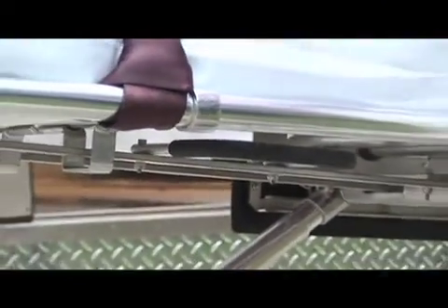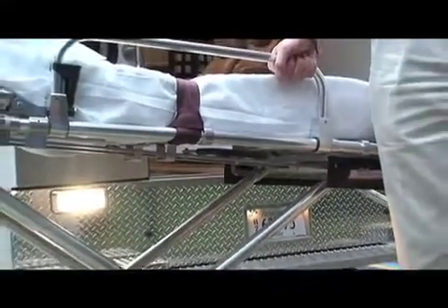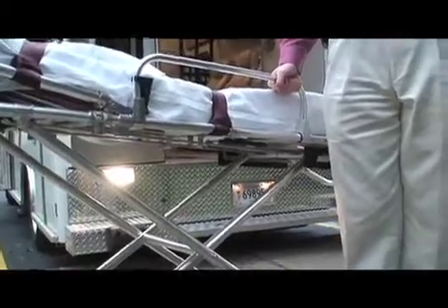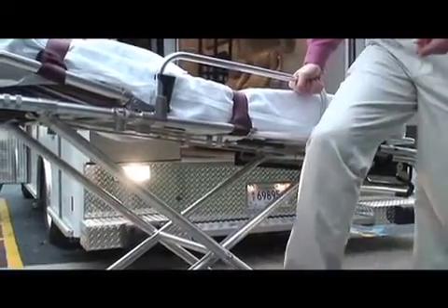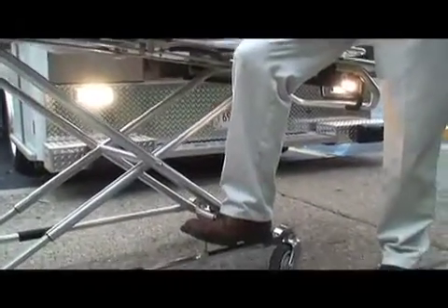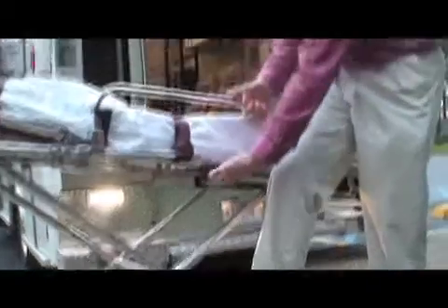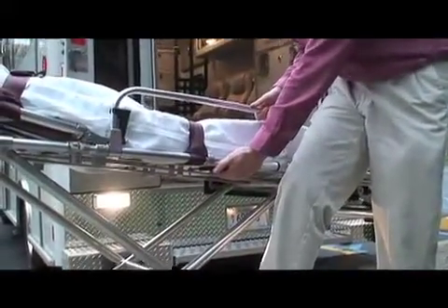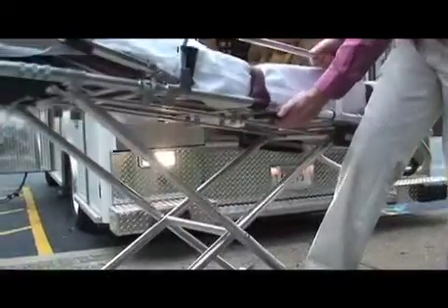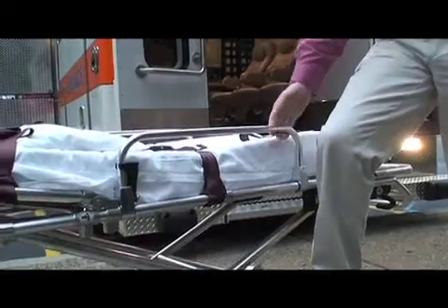There are a couple of different ways that people have found to do this, so I'll show you two ways that most people have said are easy, and then I'll let you decide which one you think is best for you. What I like to do is I put my foot on the wheel carriage here, and then lift with this hand, and squeeze the handle. Okay? Once the handle is squeezed, the stretcher can be raised or lowered however you wish. When you release the handle, that locks it into place.